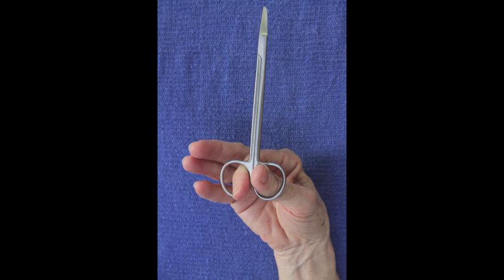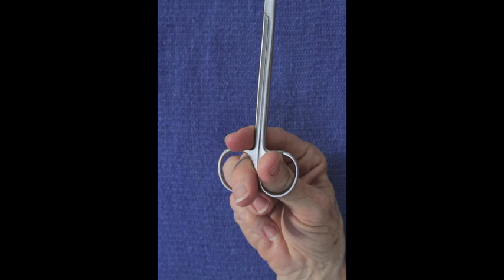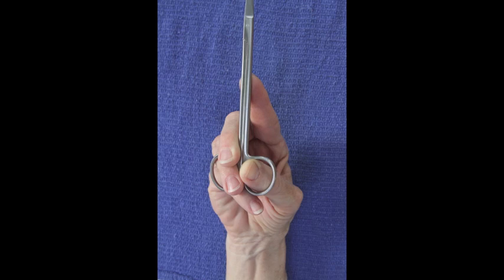In the next several videos, you're going to be seeing some scissors being held by the assistant. They're being held in three different ways. The first way is where the forefinger is being held in the ring along with the thumb. The second way is that the middle finger is being held in the ring and the thumb. The third way is the ring finger is being held in the ring along with the thumb. The third way is the way that you would want to do it.